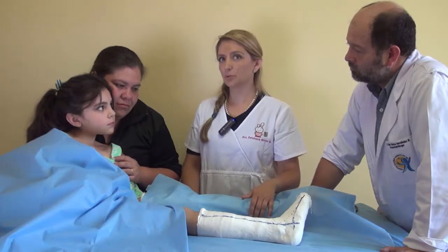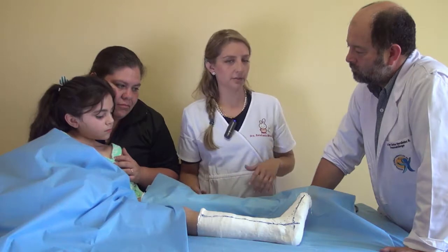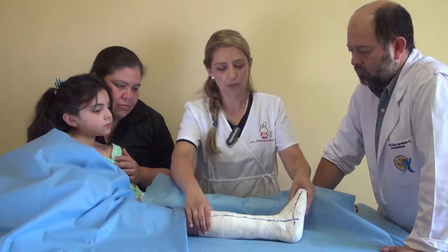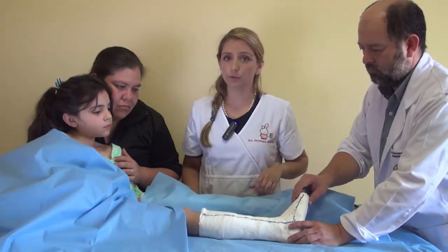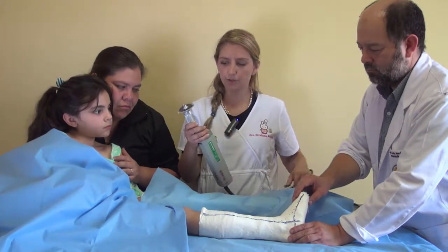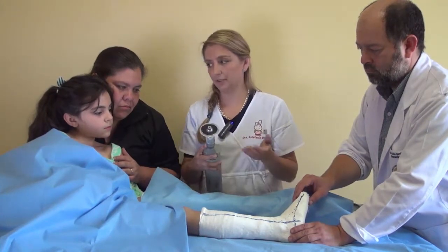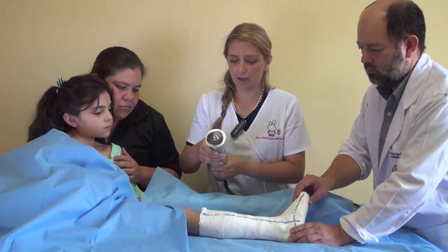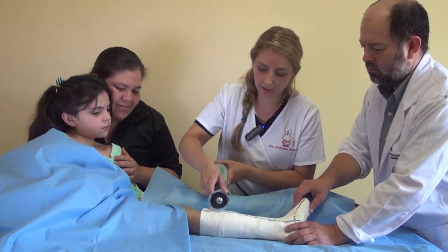This is the whole setup to remove the cast — the patient with her mother, always. Sometimes we need an assistant to hold the cast to avoid accidental wounds or injuries. We take our electric saw and show her again that it doesn't make any wounds, and then we begin to cut the cast.